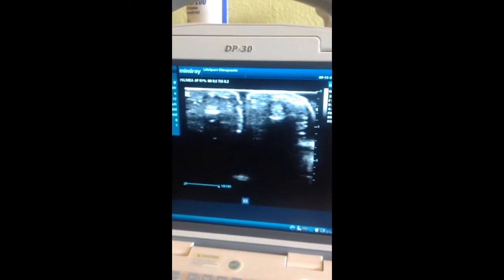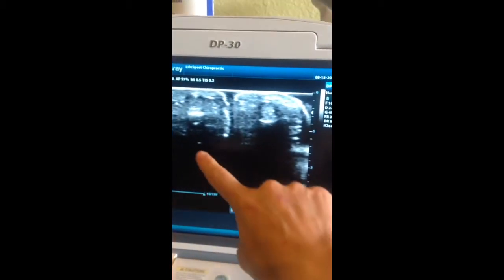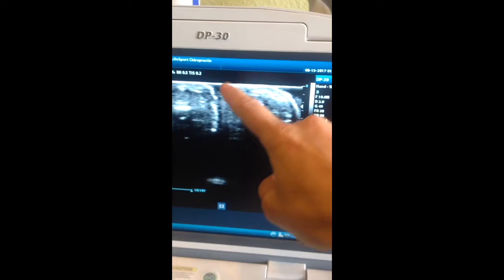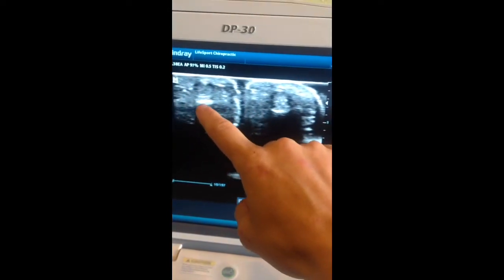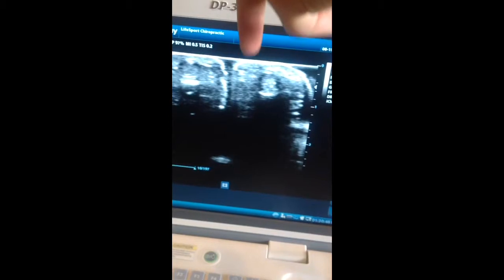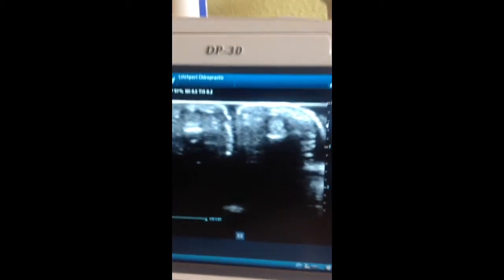Here's my ultrasound machine. I have my fingers in a bucket of water. To give you some understanding of what we're looking at — down here at the base, see how this is all black? This is the base of the bucket. Here is one finger with the skin visible, and here's my second finger. These little white discs are the bone. The ray comes in from the top, reflects off tissues and structures, and reflects back up — that's how we get this view.